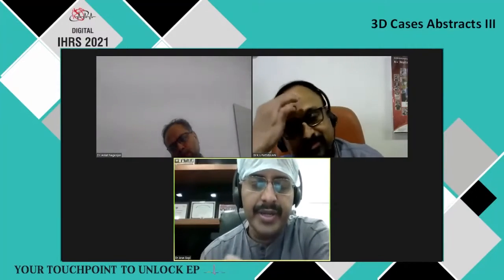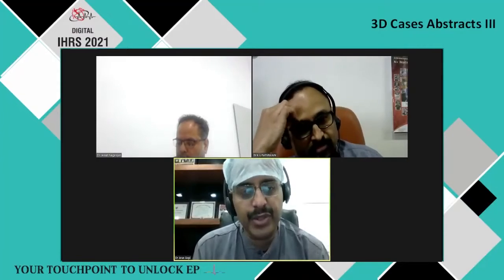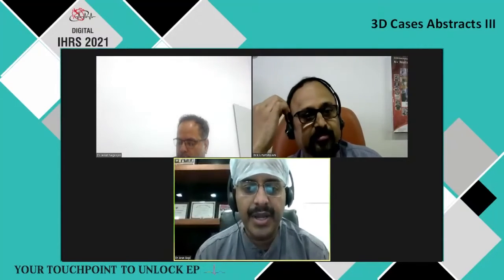Yeah, so the issue with the ablation catheter is if you're perpendicular, in line with the electrical signal, you might not record it. With the grid, we can push the grid in, ensure good contact, and with recording in two orthogonal planes, you'll get the actual signal there. So that is why grid was quite useful. If we had done a point-by-point map of the first flutter, we would have labeled that area as scar, because we were not comfortable poking with the ablation catheter at that spot.